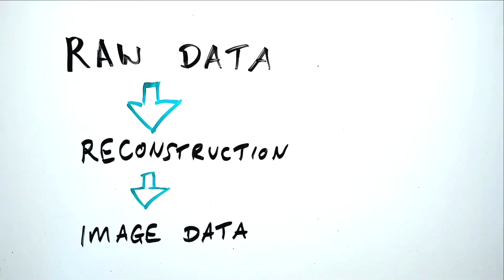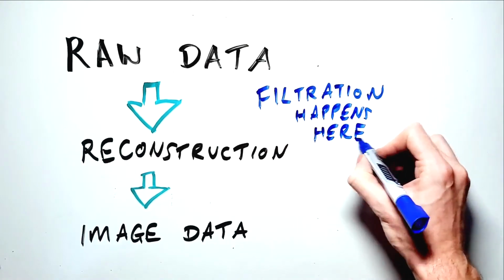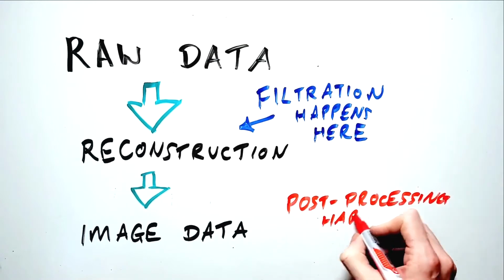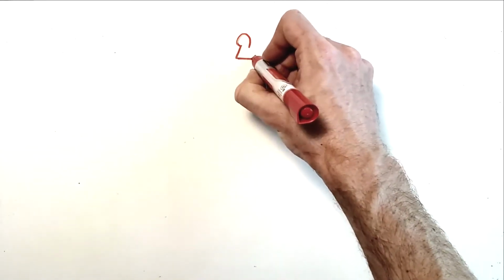Certain manipulations, such as filtering the data, must be applied to the raw data as part of this initial reconstruction process, while other manipulations like multiplanar reformatting are performed directly to the image data, which the technologist can view and manipulate visually.